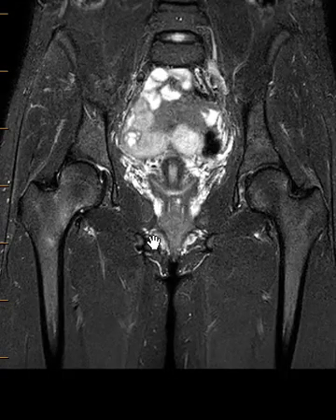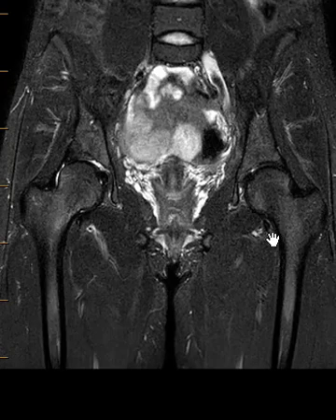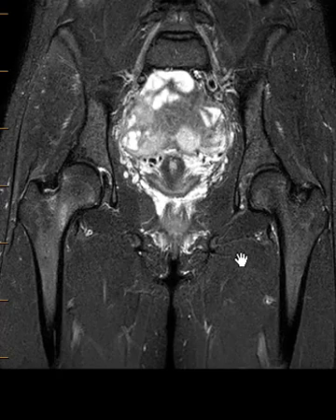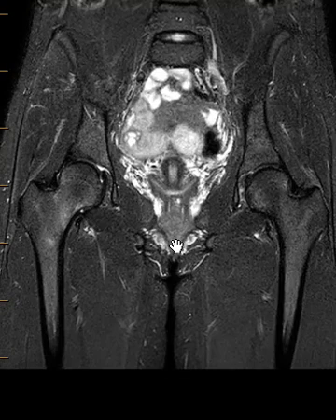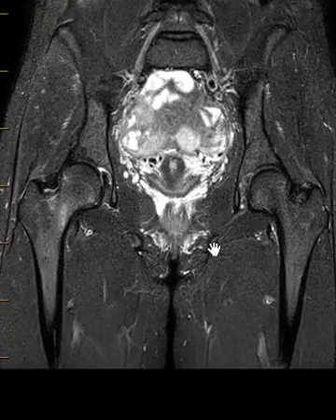But if we put up the STIR sequence, things do stand out a little bit better. So this is the right, here's the left. If we go towards the front things are good, but if we go towards the back there's a subtle asymmetry over here. In this view there's a little bright band over here — very, very subtle findings. This would be so easy to jog past, and in the past I have jogged past one of these like this.